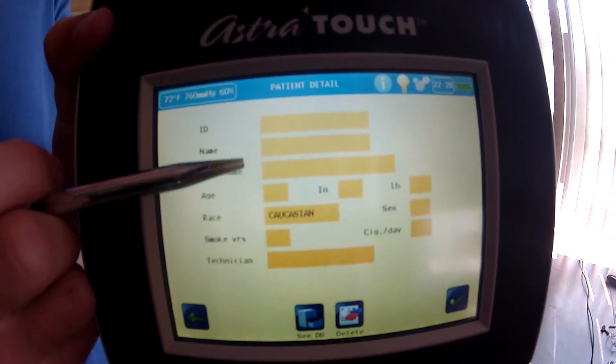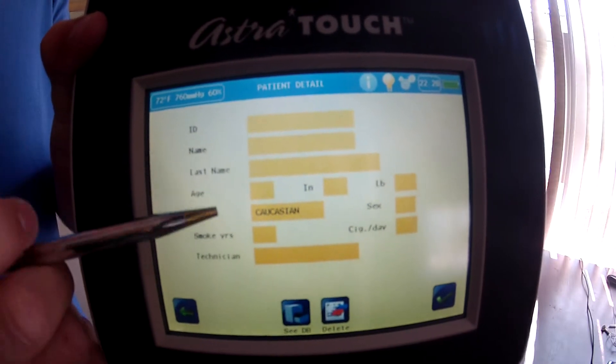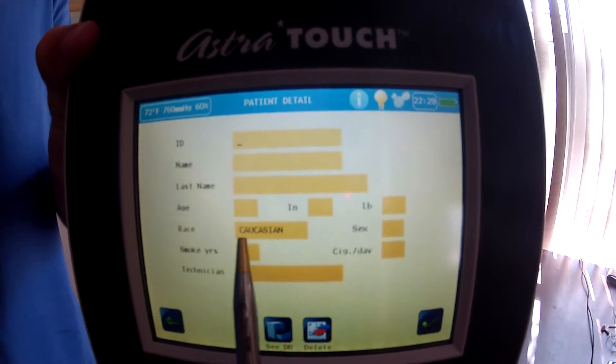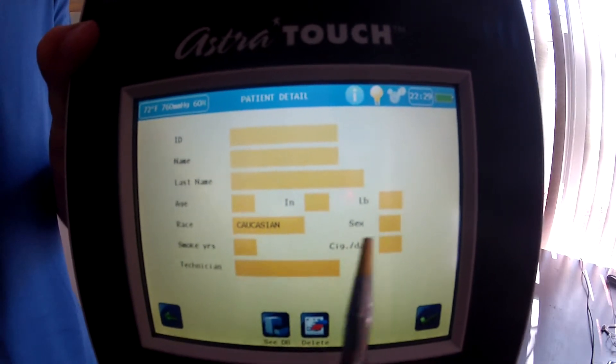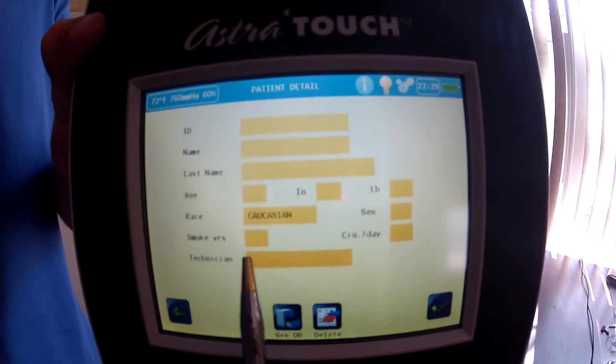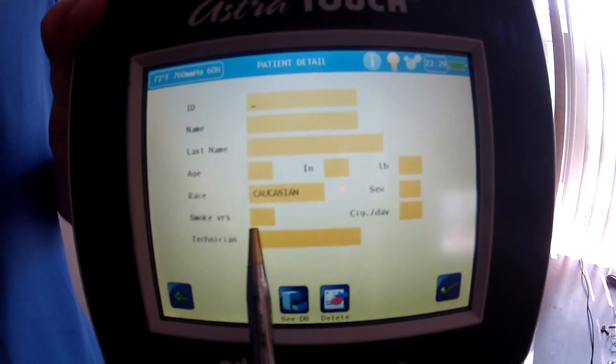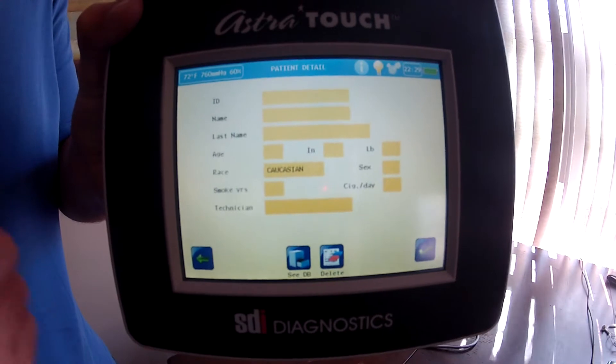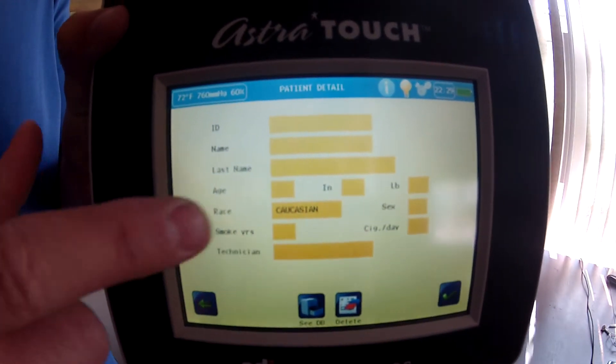The patient ID, first name, and last name are just for your records, but it also needs the patient's age, height in inches, weight in pounds, ethnicity factor, and gender. It also factors in smoking — how many years you've been smoking and cigarettes per day — and then the name of the technician. You enter the information by touching the screen.